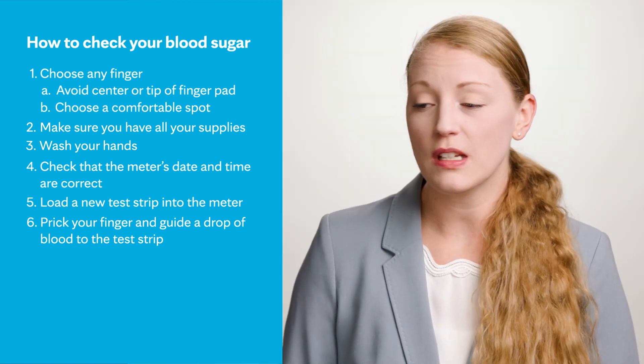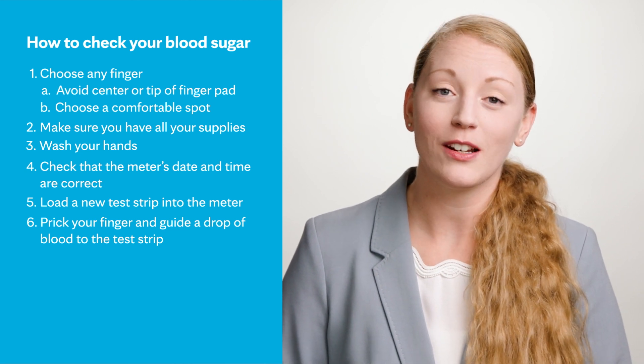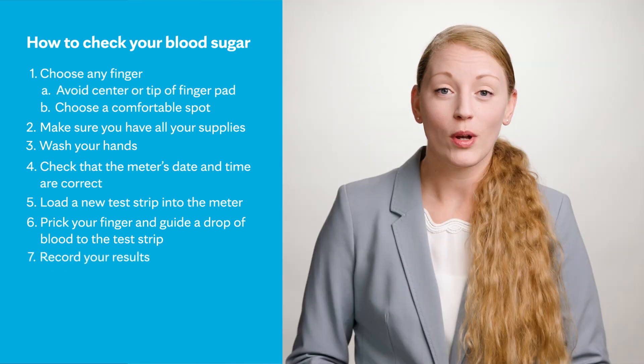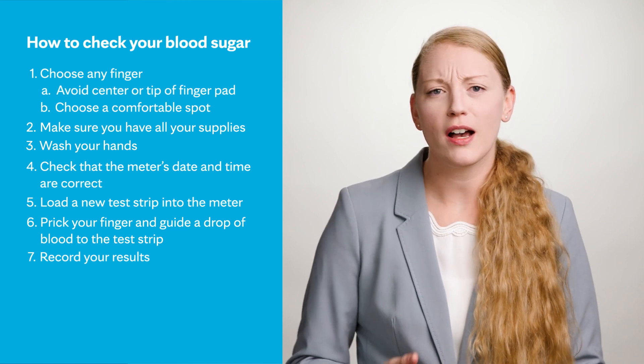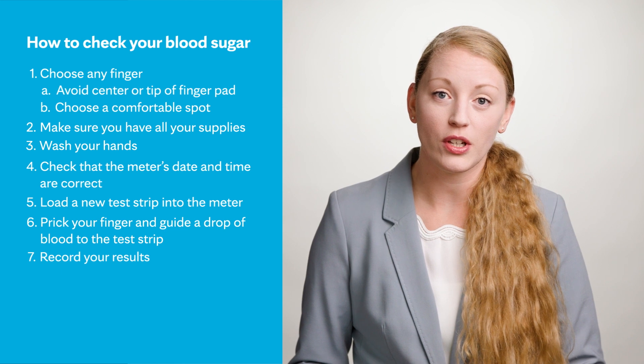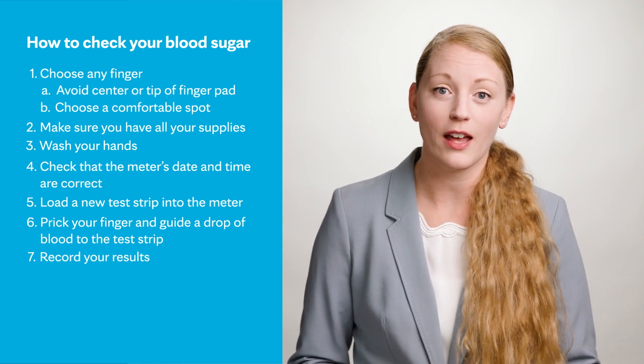Once the blood is drawn in, you'll see on the meter a five-second countdown and it'll give you your results. Once you have your result, you can record it in a logbook or a phone app — whatever is easiest for you — which really allows you to learn from your blood glucose values.